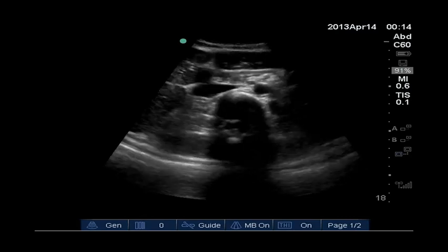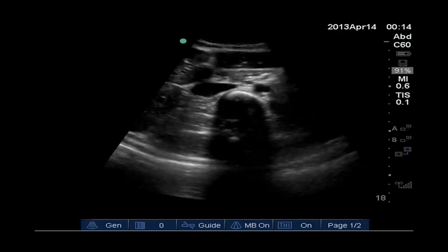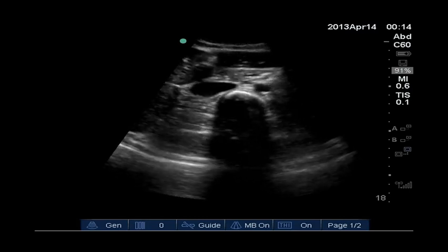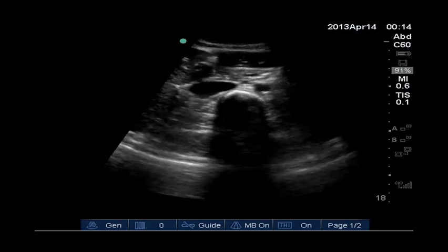Differentiating between the two vessels is important, and with little practice is easy to do. The nice thing is that regardless of proper distinguishing between the two, any vessel at the level of our sonographic landmark that exceeds 3 centimeters in diameter is likely abnormal and merits further evaluation. We will touch on these sources of false positives in our next screencast in this series.